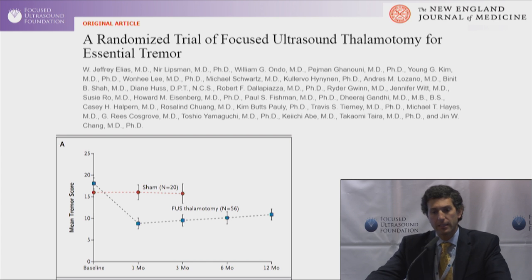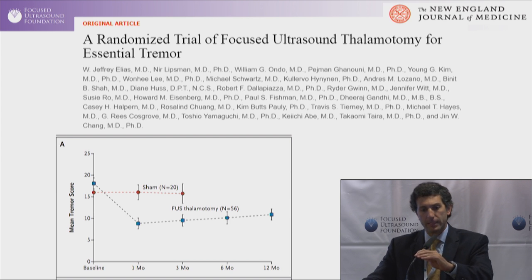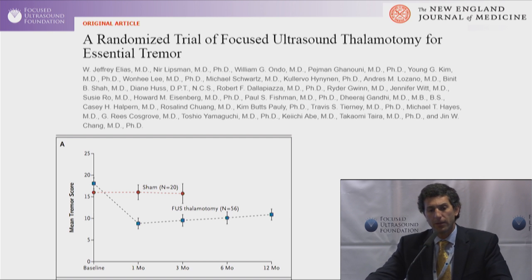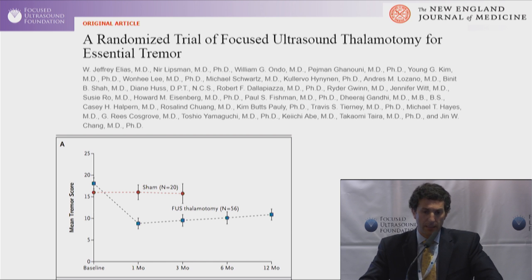We're very pleased to release our results from this international randomized controlled trial this week at the Focused Ultrasound Symposium. This was a trial that investigated the effects of focused ultrasound for a problem called essential tremor. That's a very common movement disorder problem. It's in fact the most common movement disorder condition that affects people. We enrolled patients with moderate to severe tremors. These are patients that are losing the ability to use their hands, and they're refractory to medical treatments. So they sought tremor control and improvement in their functional aspects in day-to-day life.